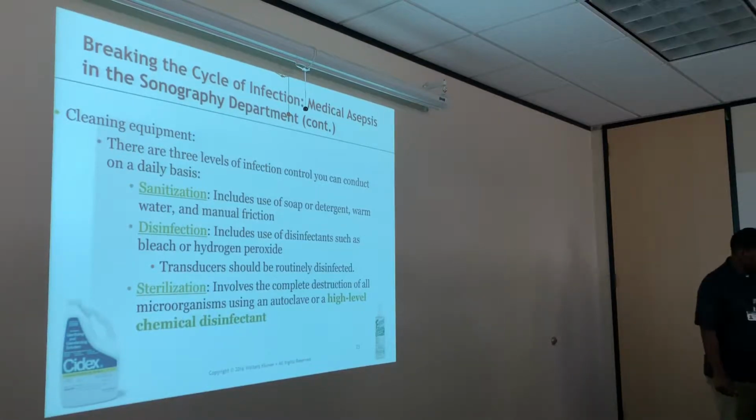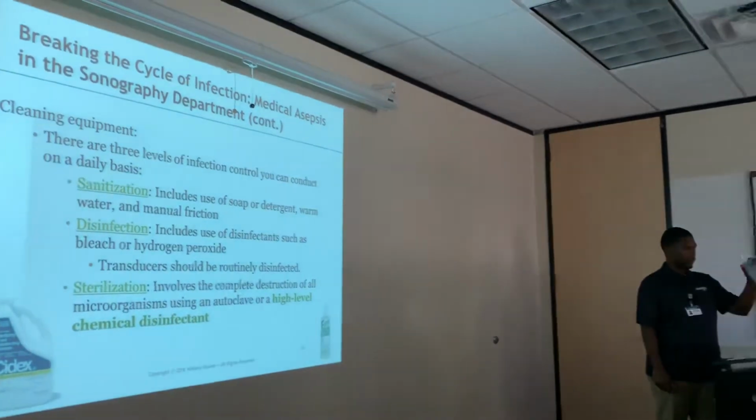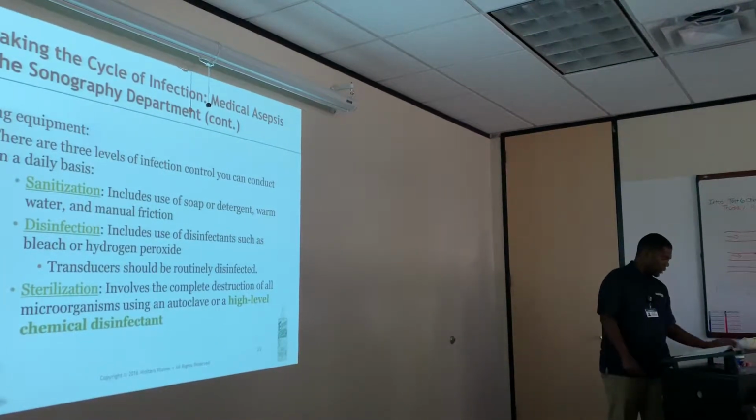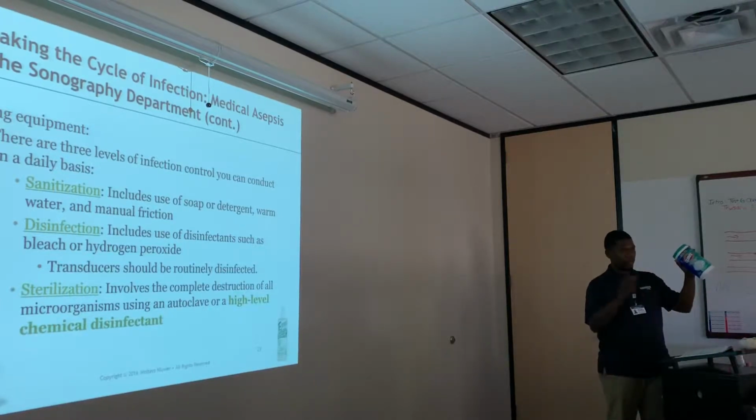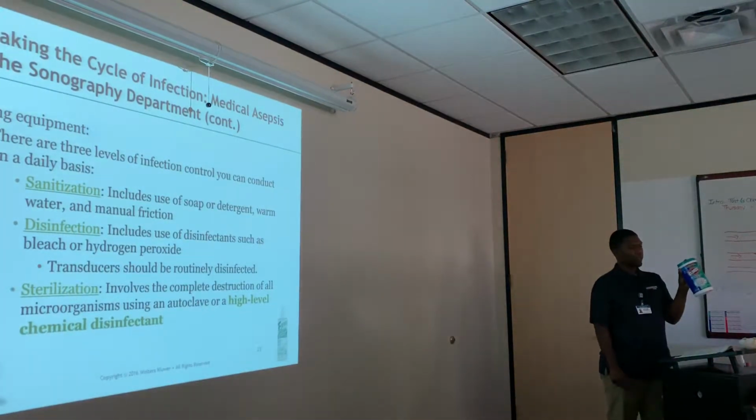Okay, so I was just reading, guys, with the T-spray as well. You can spray on the wire as well. Also, I know we use the Clorox wipes. Guys, that's up to the manufacturer. When you're cleaning the transducer, it's okay to use these on the transducer. Just don't wipe the crystals. Just don't wipe the parts that come in contact with the skin with this, because you could dry out the crystals or cause damage to the crystals. Okay, so if you're using a Clorox wipe, you can use it to clean the probe, but also make sure you don't get the top of the transducer. Use that T-spray for that.